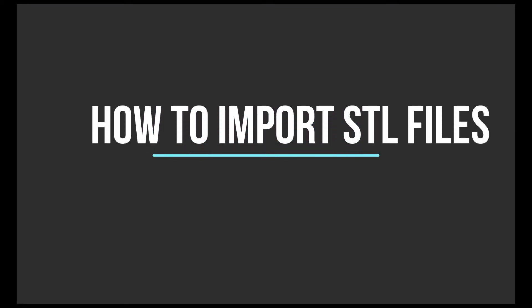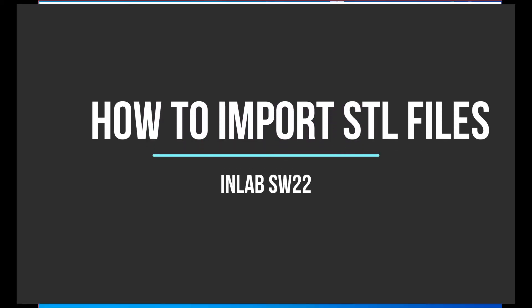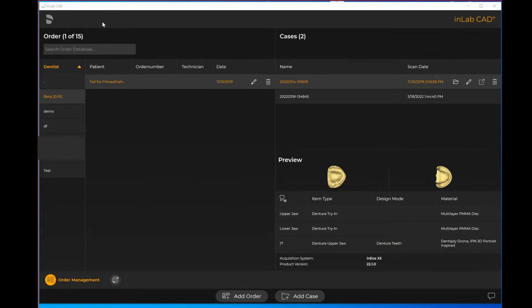In this video we are going to review the workflow on how you are able to import STL files to the inLab software 22.